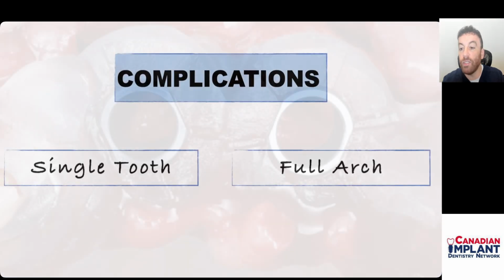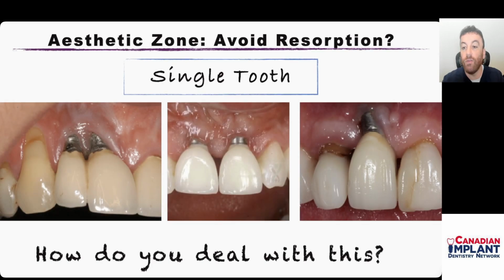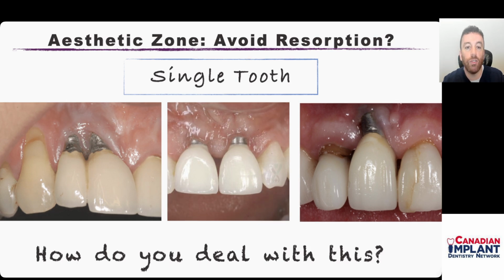And complications can happen in single teeth and also full arch cases. But before we jump into full arch, it's important to understand that the complications that we deal with in single teeth get magnified in full arch. So let's look at single teeth first. For a single tooth, how do you deal with these kinds of complications? It can be a challenge. Either implants are placed too facially, maybe the implant diameters were too large, maybe the tissue has receded with time. How do you deal with these kinds of situations?